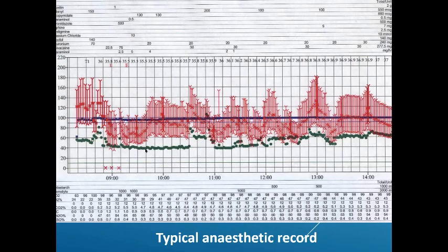Here is a safer sleep printout with which you are probably familiar. As you know, in complex cases, the physiological variables can be all over the place, including artifacts. EDDI has a built-in artifact rejection analysis system.